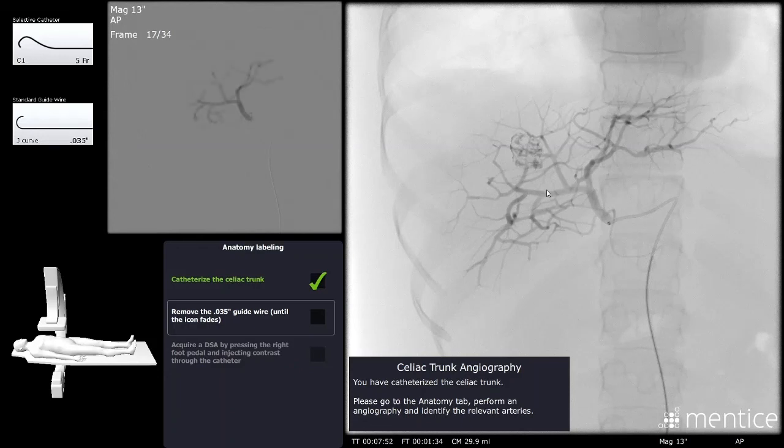In some centers they don't use chemo beads or a chemo agent. Some centers do what they call bland TACE, which is basically where you use normal particles to perform the embolization. Okay, the idea is that you really should be using small particles to get that distal infiltration into the tumor bed. And so they would probably start off with probably 100 microns, and in some places 50 micron particles to get out to that kind of infiltration that you want to get.